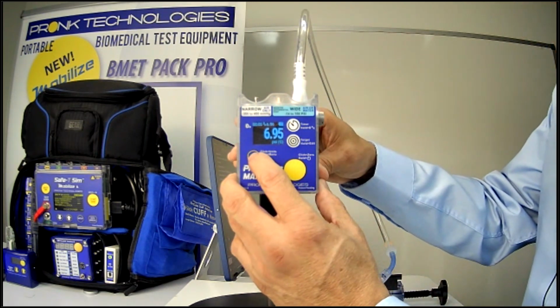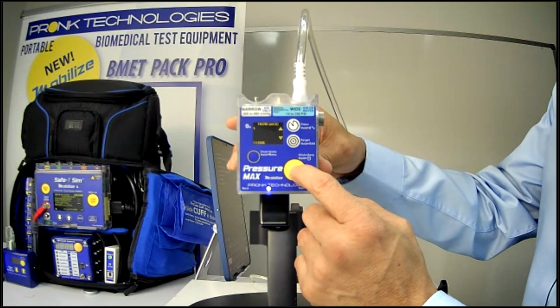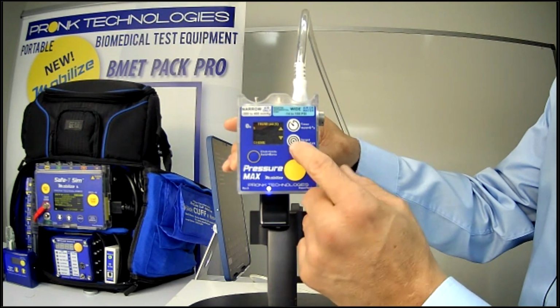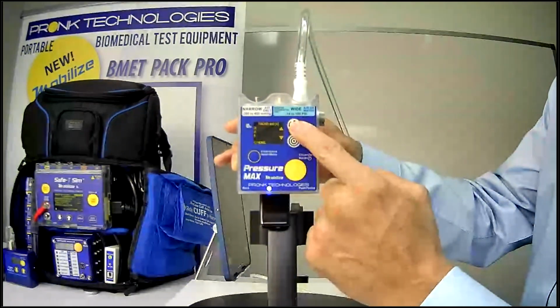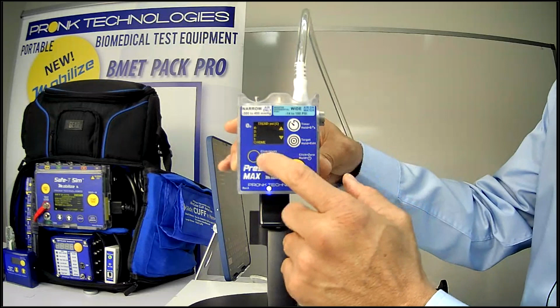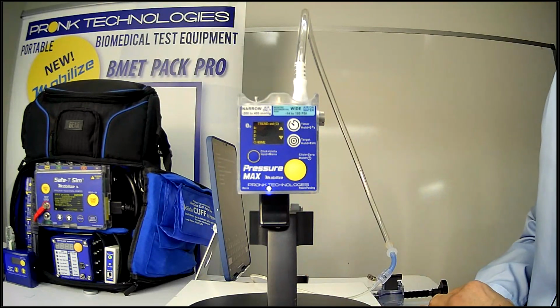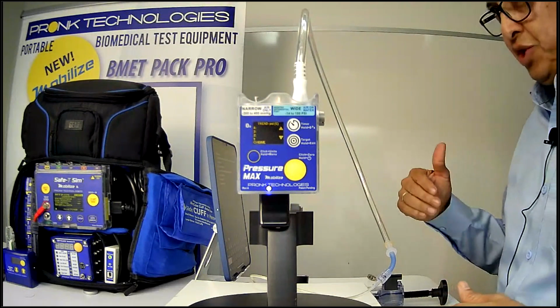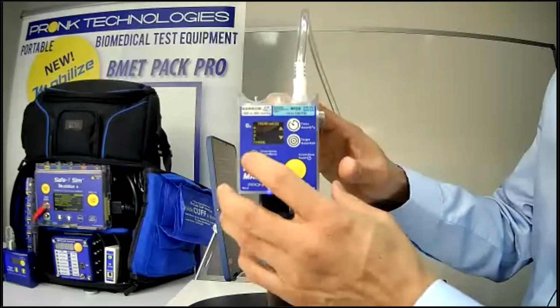So we mentioned that you can edit the targets here. There's a trend function here, which will get enabled as soon as I start and go into the trend function here. So as time goes on, you'll see that the pressure measurements will increment and be displayed here in 1-minute intervals, so that you can trend maybe changes in pressure for the last 15 minutes to be able to see those values. So we'll come back to that in a moment.